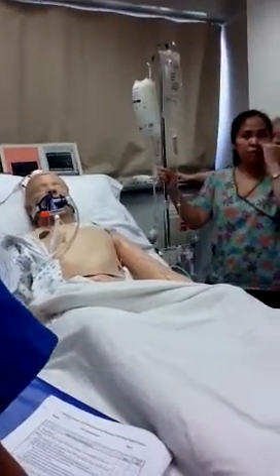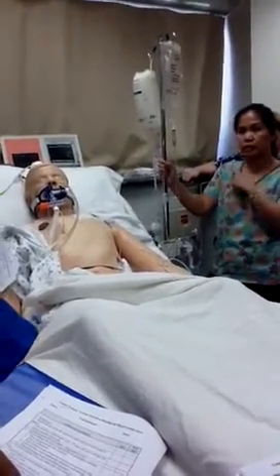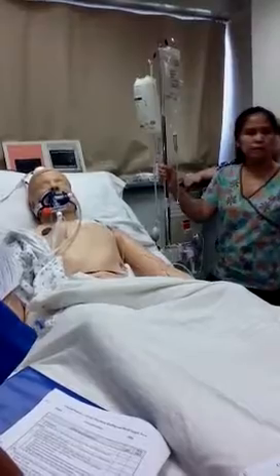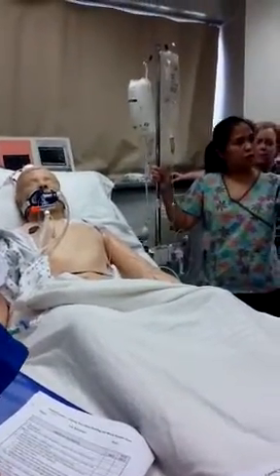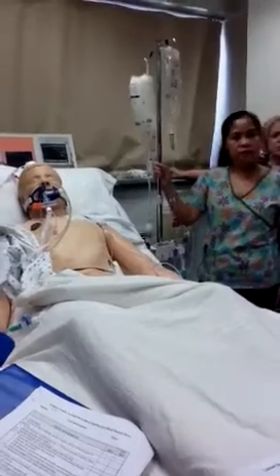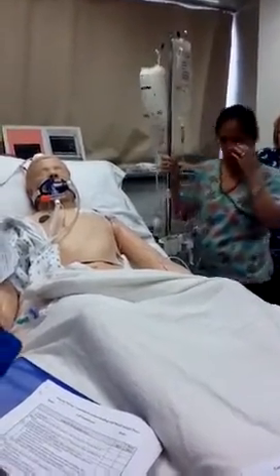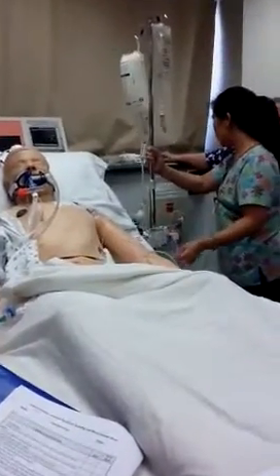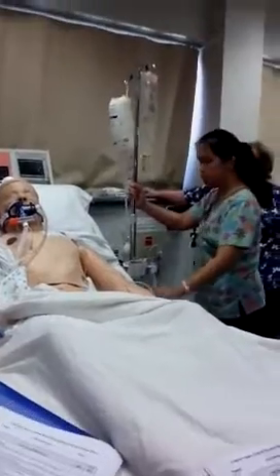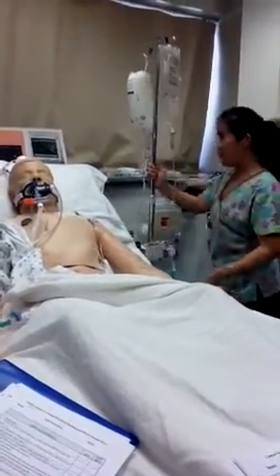For a normal one, but when we have a patient who's septic, things like that, we definitely won't want that to be 4. So it's going to be higher anyways. What is the value? Usually it's 2 to 4 around there. So very low, but even with a 9, it's very low for a critical care patient. Anyway, so that's that. And I think they'll learn it. Okay, so that's how you would level and zero that as well.